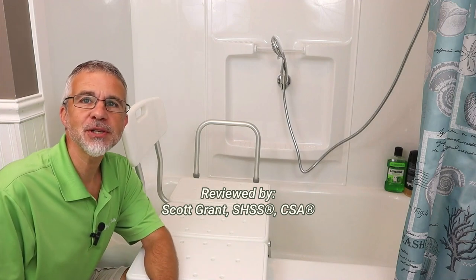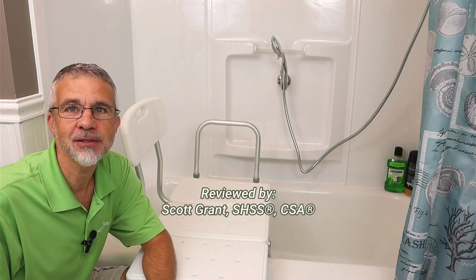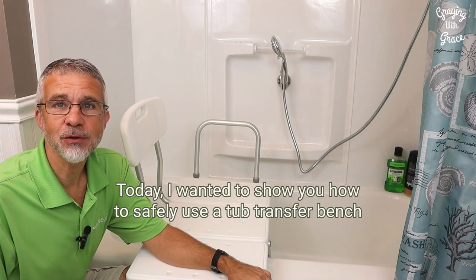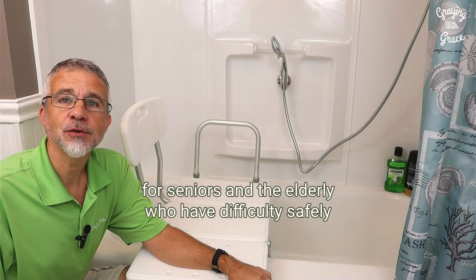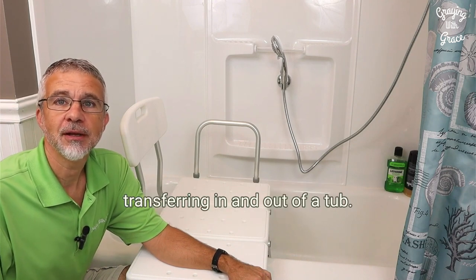Hey there, my name is Scott Grant. I'm a certified senior advisor and senior home safety specialist with Graying with Grace. Today I wanted to show you how to safely use a tub transfer bench for seniors and the elderly who have difficulty safely transferring in and out of a tub.